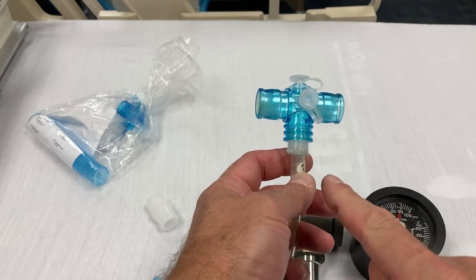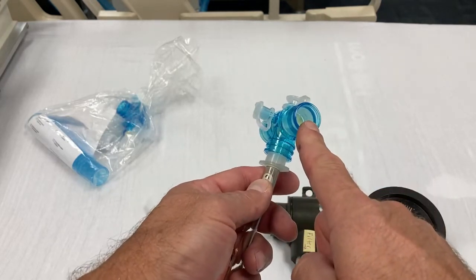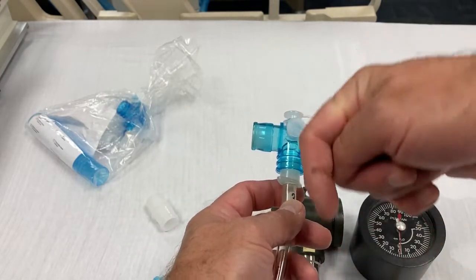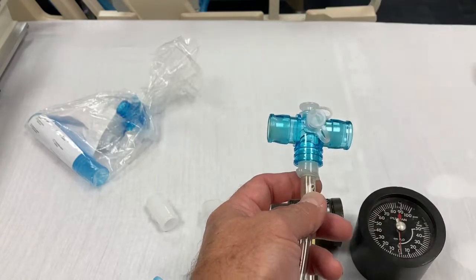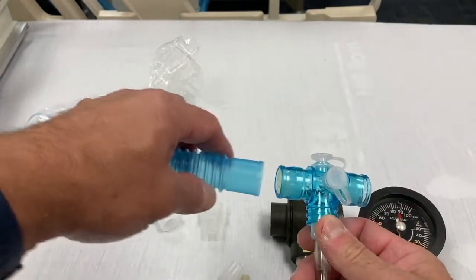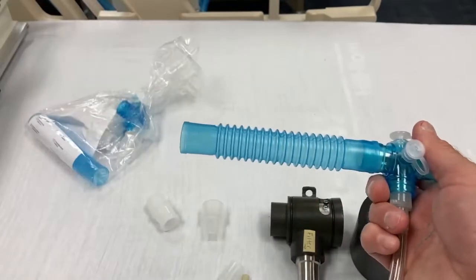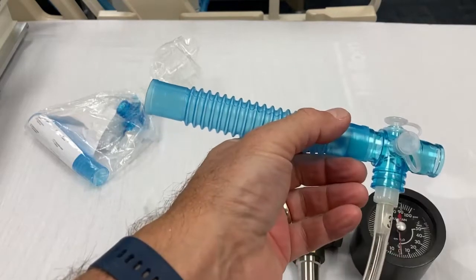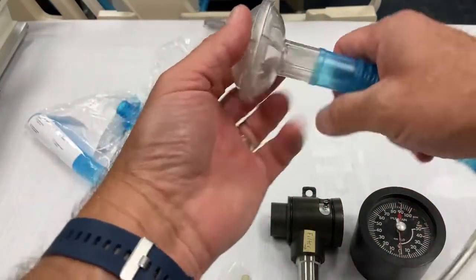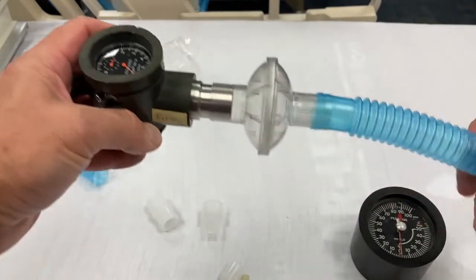When they go to exhale, think about the air coming out. It will close this side and go out this side. So they breathe in through this side and out on that side. So we want to measure on the exhale side. So we can put a piece of corrugated tubing there and our filter and hook that right to our respirometer.